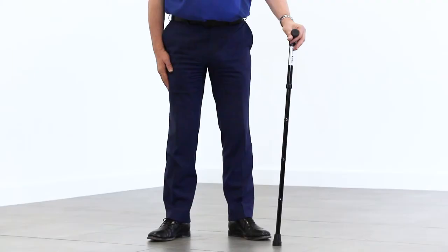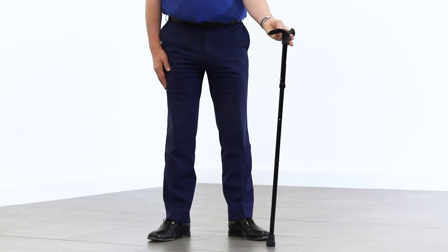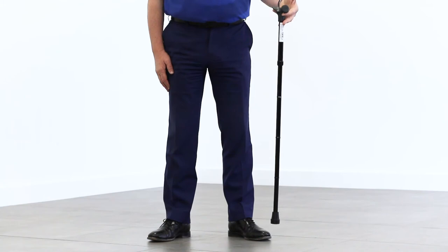If you're dealing with a condition like arthritis or rheumatism, you'll find the shape of this handle is more forgiving on your hand and wrist and more comfortable to grasp than a standard walking stick handle.